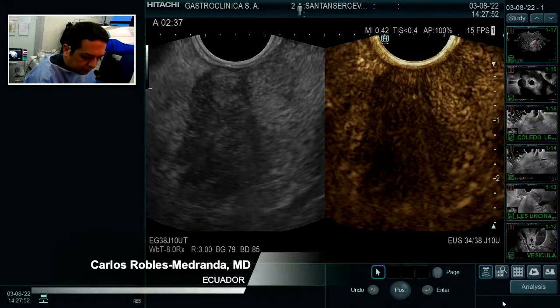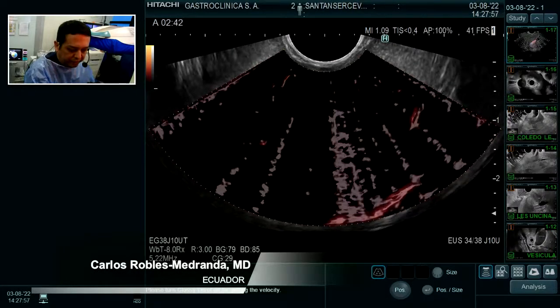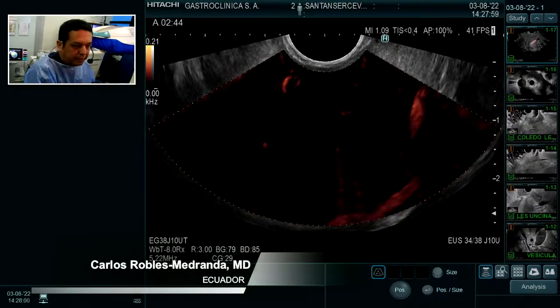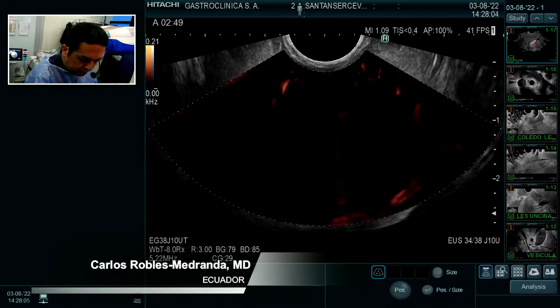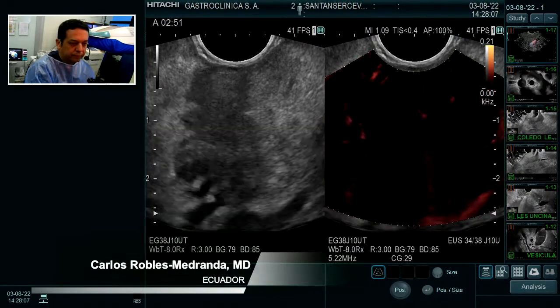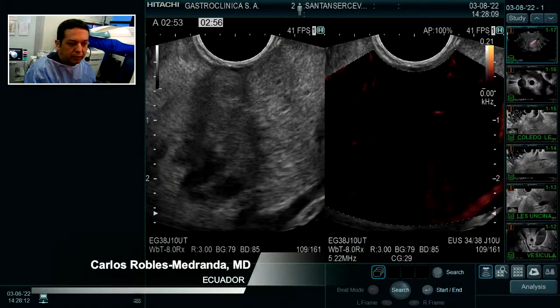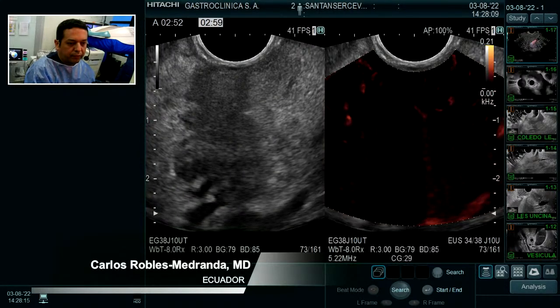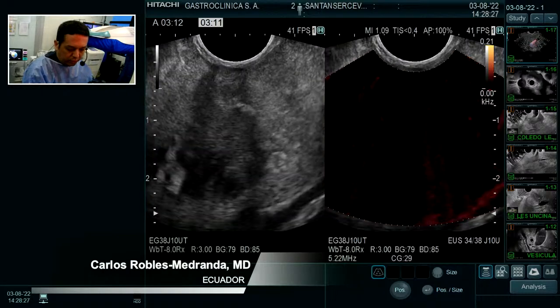And I will do DFI now. You see the vessels. We can see in two ways. So normal view, you see here. So no contrast captation. It's the same captation as the contrast. You see, just peripheric vessels. This one here, this one, and this one we saw during the contrast captation, but no contrast captation inside the tumor. So to me, this is probably pancreatic adenocarcinoma.